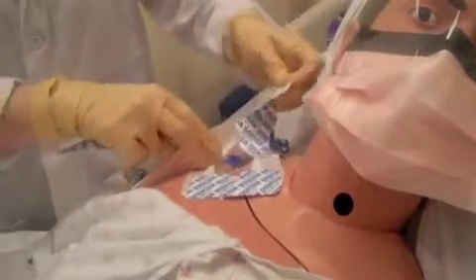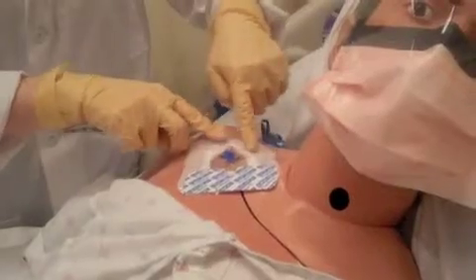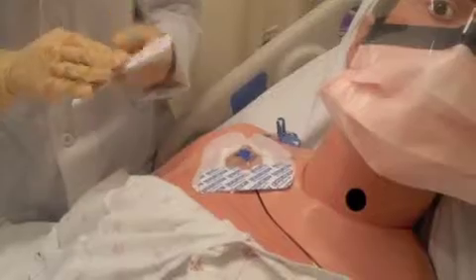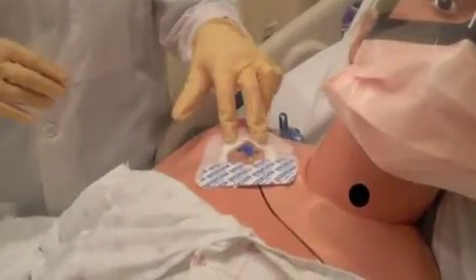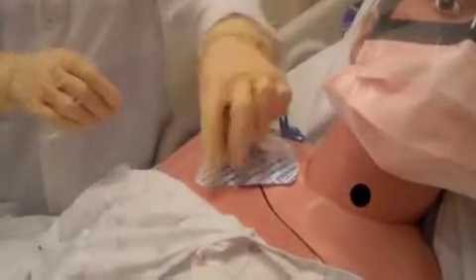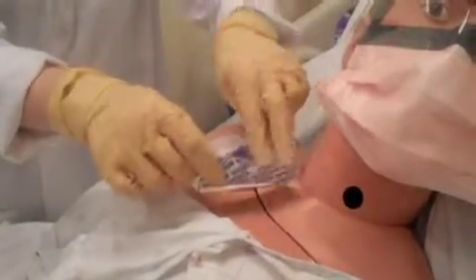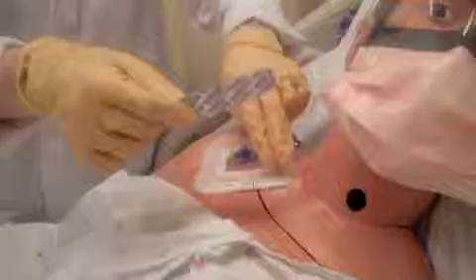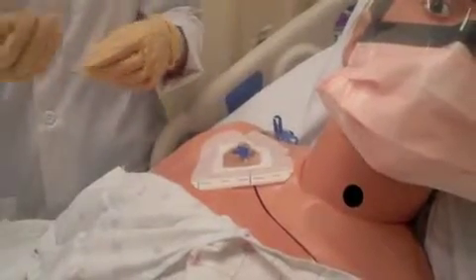The nurse will apply the dressing and smooth out any wrinkles, starting from the center and moving outwards. Now remove gloves unless indicated by isolation policy.